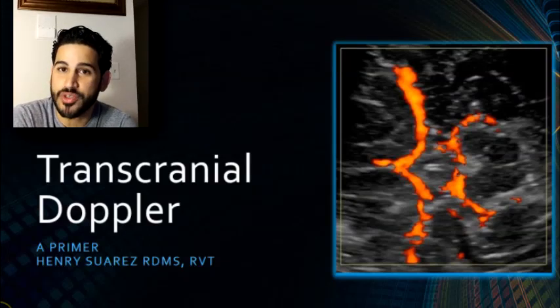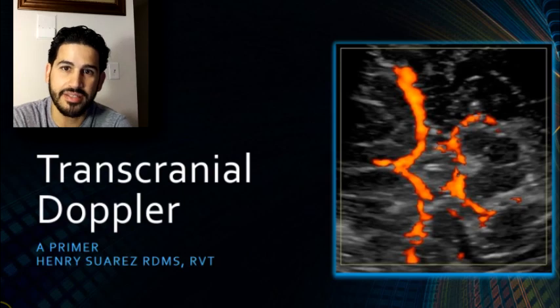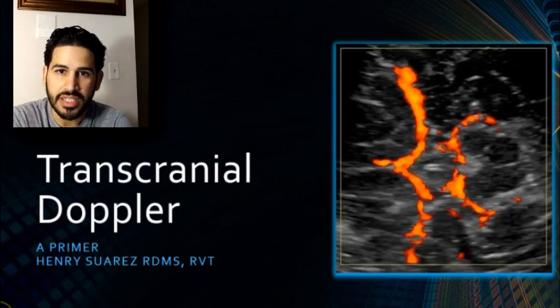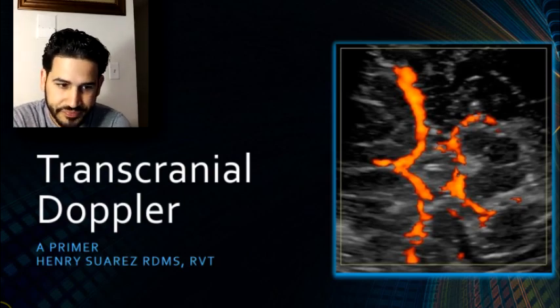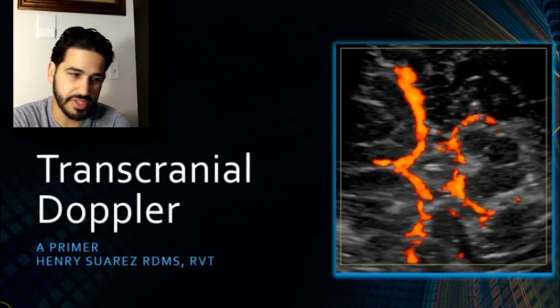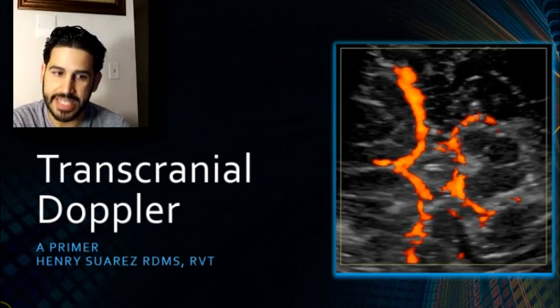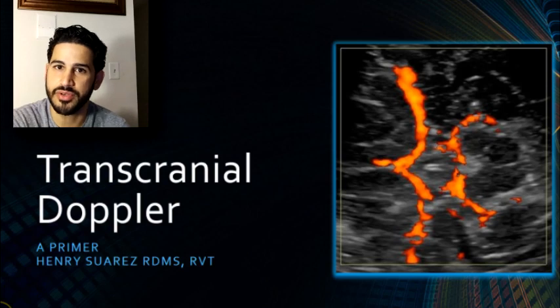Today I'm going to go over transcranial Dopplers. Transcranial Dopplers are quite easy once you learn how to do them. The protocol is quite simple. You just have to follow a few steps. You might encounter some problems on patients who have thick skulls, but other than that, it's pretty straightforward. I'm going to go over the techniques and then do some case reviews, okay?